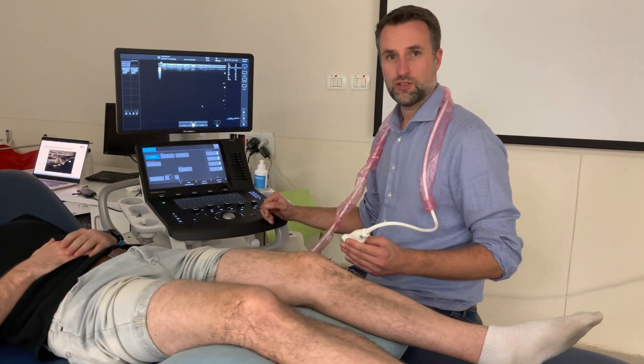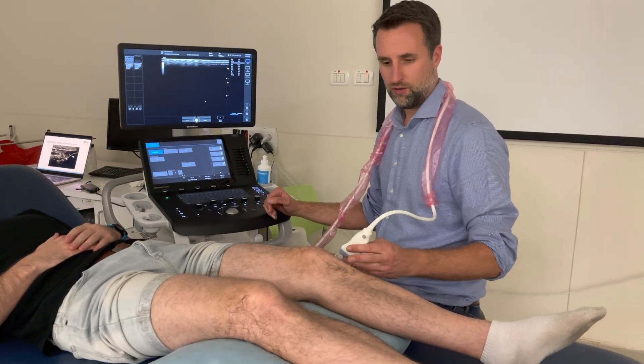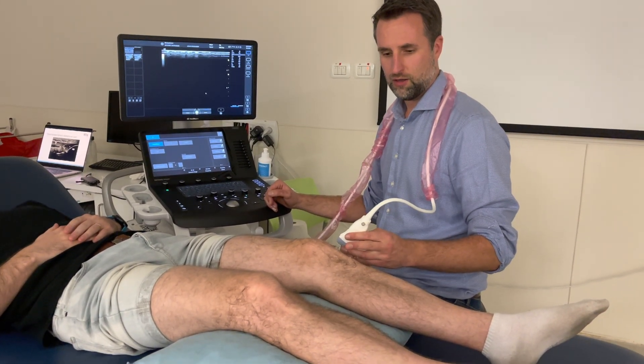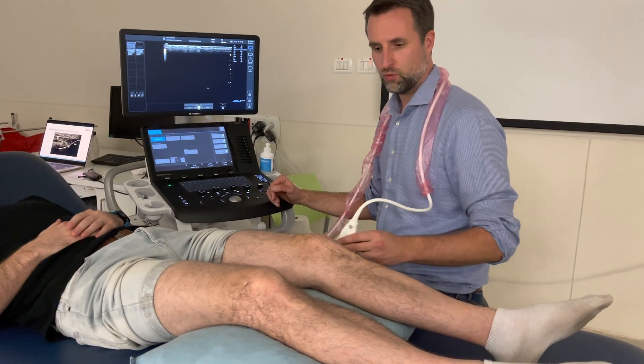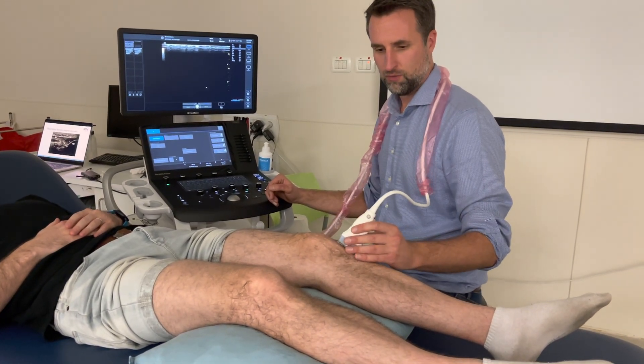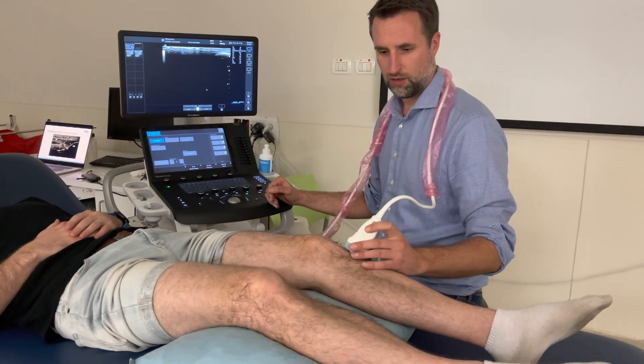I'm going to take a look at the extensor mechanism of the knee — the patellar tendon, patella, and the quadriceps tendon, and the structures surrounding that area.